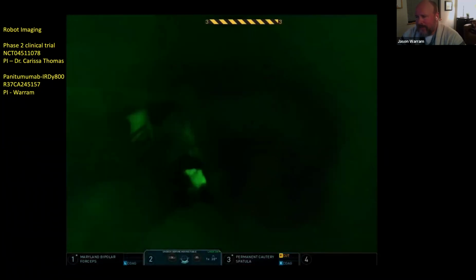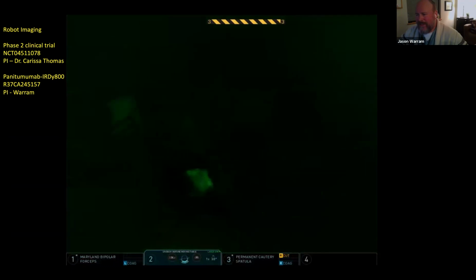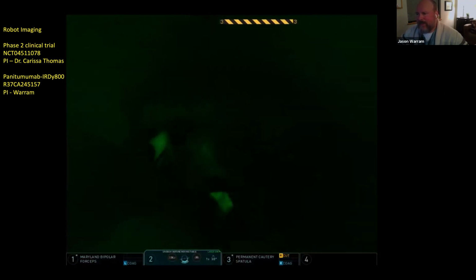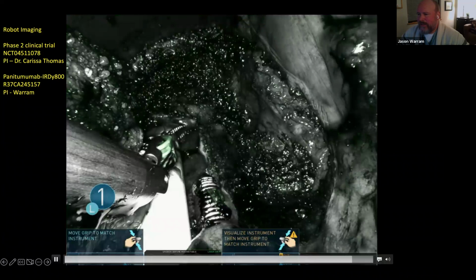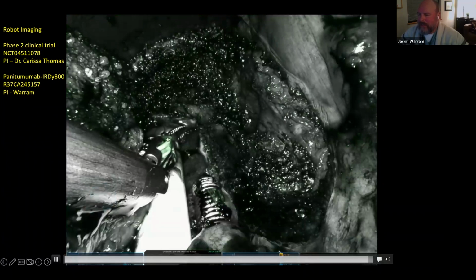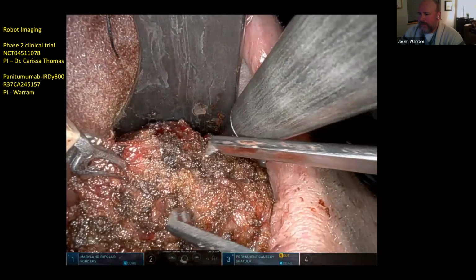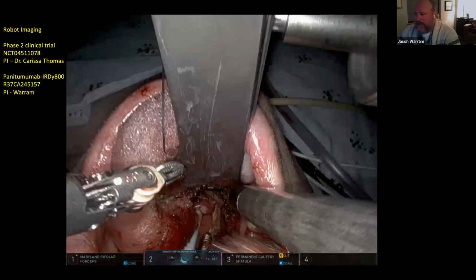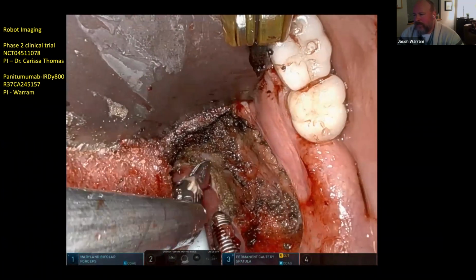And with the Firefly technology, the imaging technology that's contained on the robot, which has come a long way in just the past decade in terms of hardware and software advancements. It used to be pretty poor, but as you can see now, it's gaining a lot of sensitivity and a lot of the background has been washed out. We're showing this tumor fragment that was left in the wound bed juxtaposed to the imaging tool that we lay in place and use as a normalization factor. We're expanding this technology into other head and neck procedures and into laparoscopic procedures using robotic surgery.